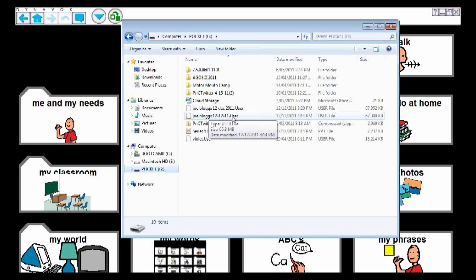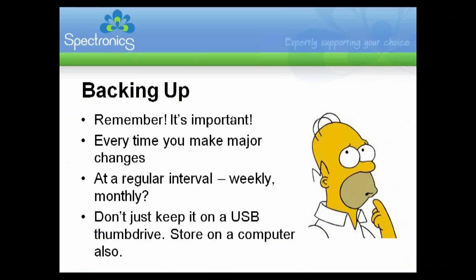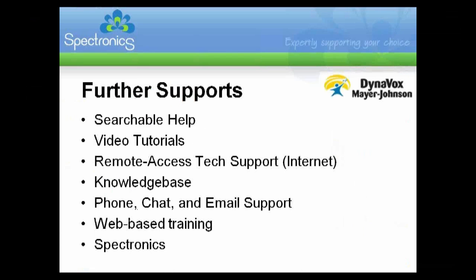Now, we're going to go back into the PowerPoint, and there's a few other things I wanted to cover. The supports that are available to you when you're using the device or the computer software. There's a number of ways that you can find things out if you need to ask a question or to remember how to do a backup or how to modify.